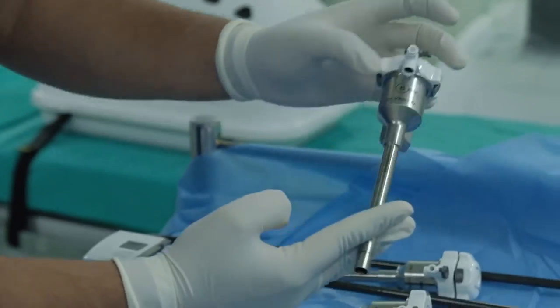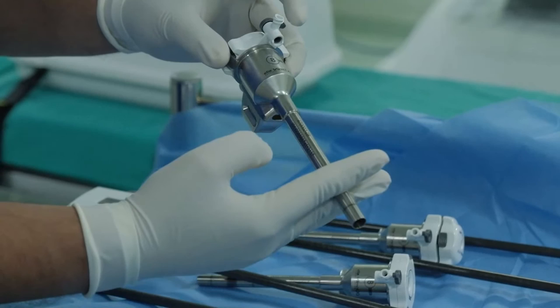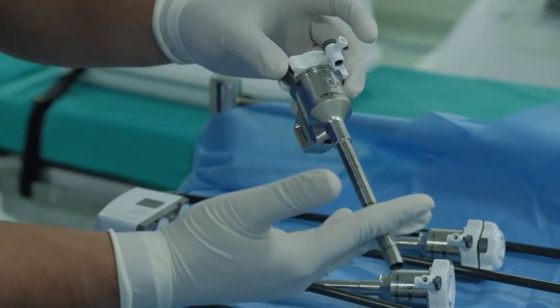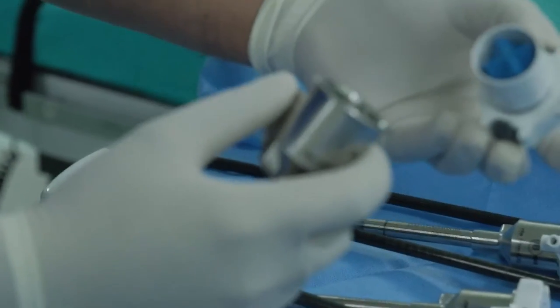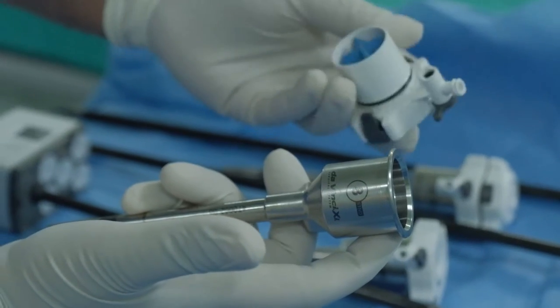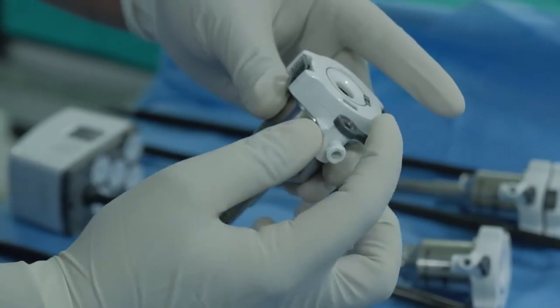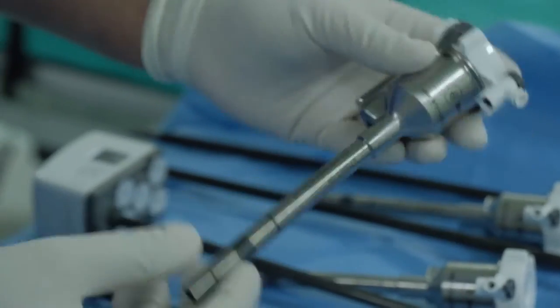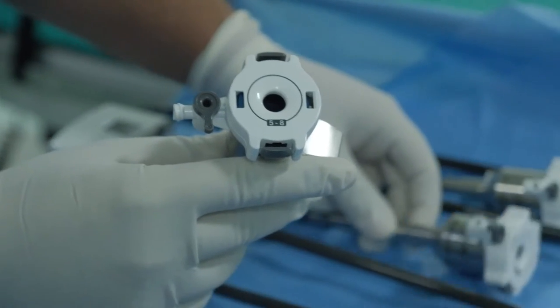And this is different from laparoscopy, where this point actually acts as a fulcrum and it leads to more trauma to the abdominal wall. So the rate of incisional hernias after any surgery and the pain is less after these robotic cannulas. They have a cannula seal here. You can see this is detachable, this is a disposable part, this is a reusable part. These cannula seals can be attached, they have an egress and ingress of air facility also. So you can attach the gas to these ports. And this is a 5 to 8 millimeter cannula seal. So you can use a 5 millimeter instrument or an 8 millimeter instrument as well.